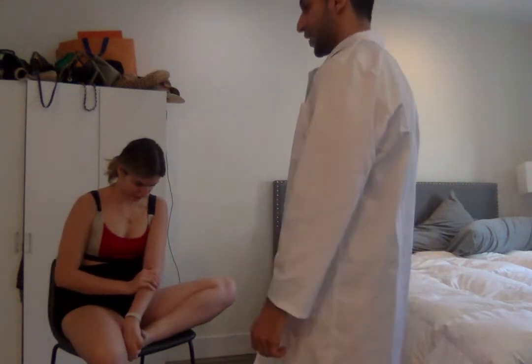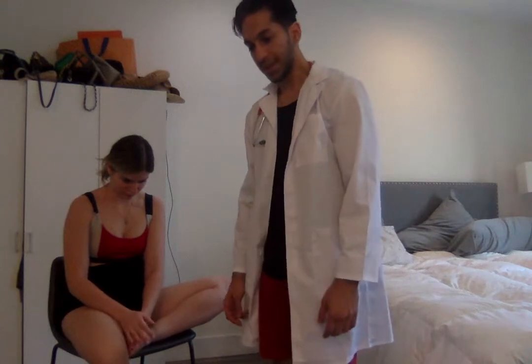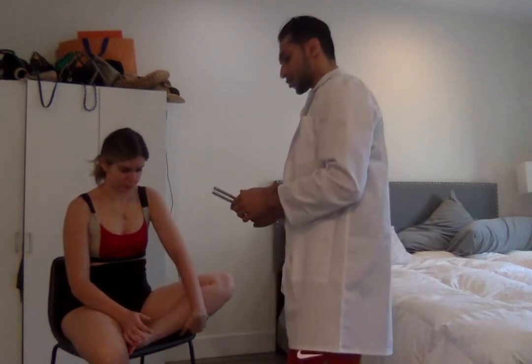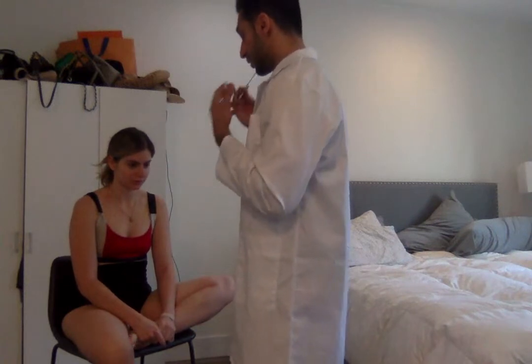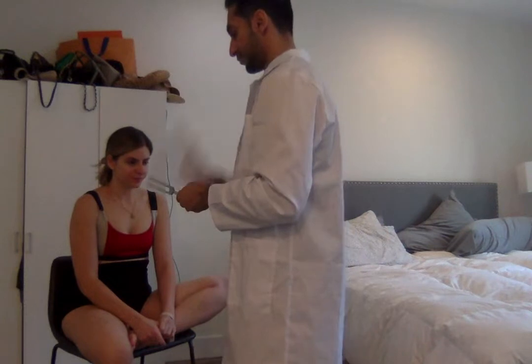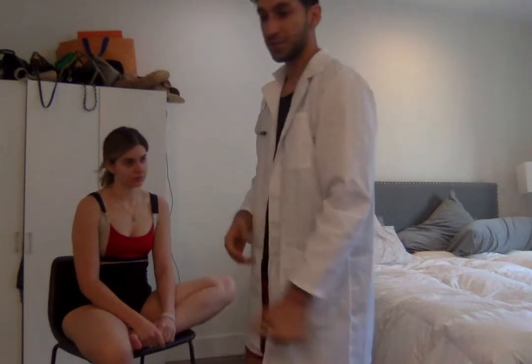Okay, so next we will test for your hearing, and we're going to test for the acoustic nerve, which is cranial nerve number 8. We'll be testing that with the tuning fork. So I'm going to strike this tuning fork. You're going to let me know if you hear the noise equally on both of your ears, okay? Equal in both. Okay, so that's a normal finding. That was the Weber test.